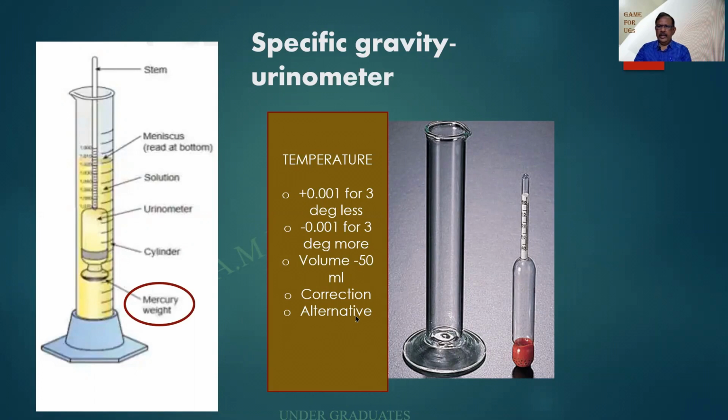And there are also alternate methods you people should be knowing. So there's a bulb over here, and then the neck with the graduations. This is a jar.